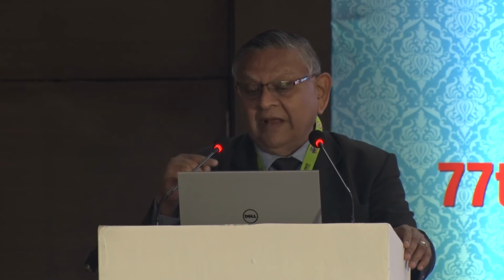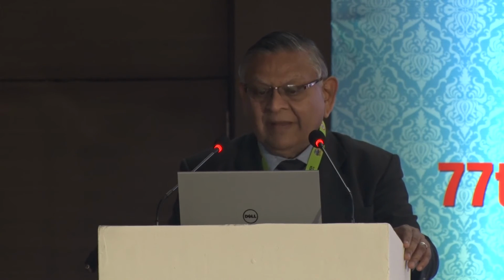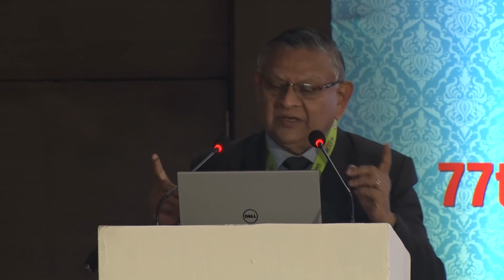Now every time you don't have a very bad extension, you can see that the rhexis is gone out. I'm making the nick. It's difficult because the capsule is not that healthy, or a hard cataract, and you can see even the rhexis has gone here up to here. So my idea in showing these videos is, why stick to this one method, supracapsular cataract. See, it was about to extend here, but still we have to manage and make sure.